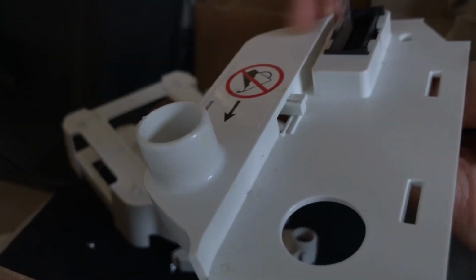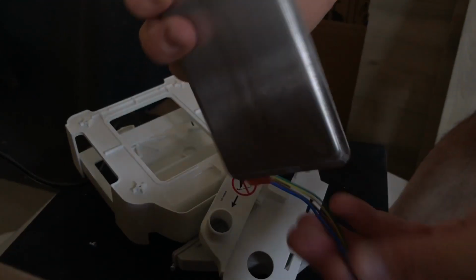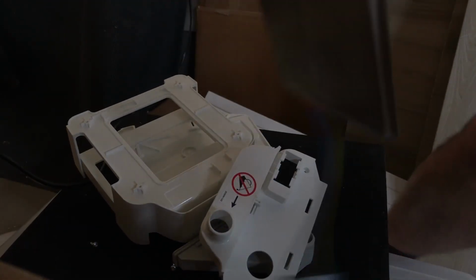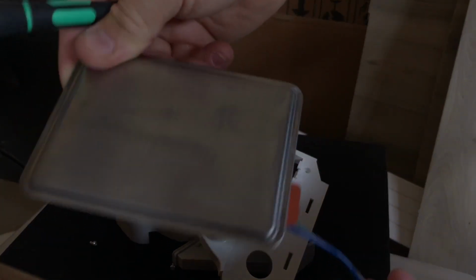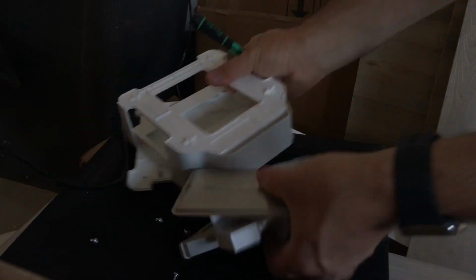One more moment here while I open this up. There. Okay, heating pad, and that's it, 4 wires. Should be able to reverse engineer this and then figure out what it takes to heat up. That's basically that part. Now, let's go and have a look at the actual main unit. I'm going to unplug this there.